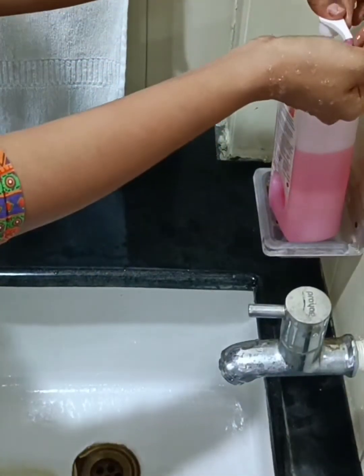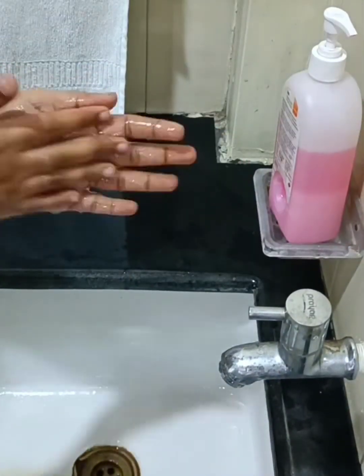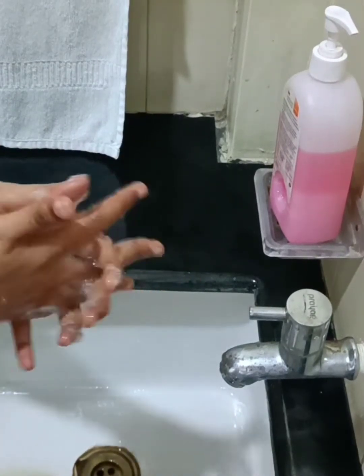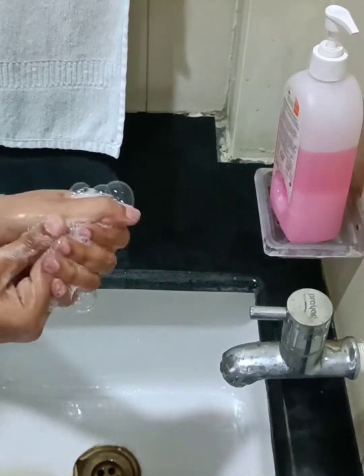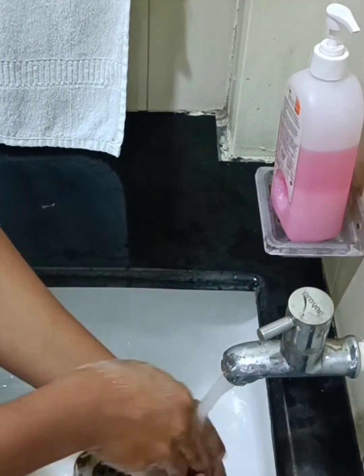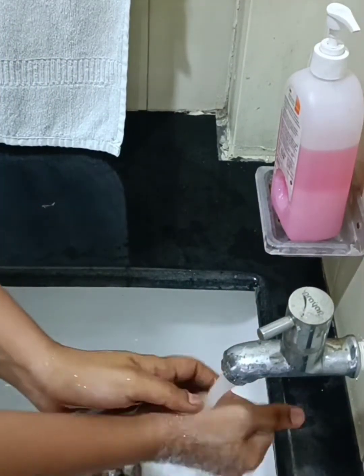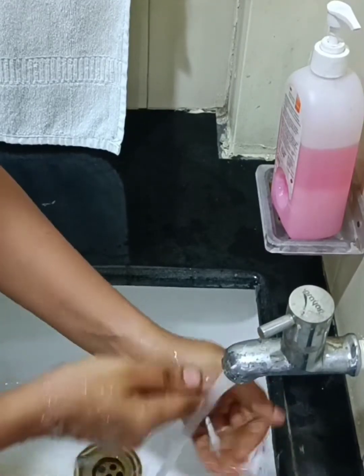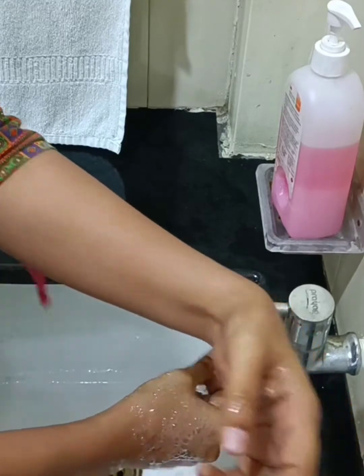Hygiene plays an important role in dealing with contact lenses. Always before putting contact lenses, you should wash your hands with water and soap. Clean your hands properly and then dry them off using a towel or a tissue paper. Always this should happen before putting the contact lens. It is always good if your nails are trimmed.